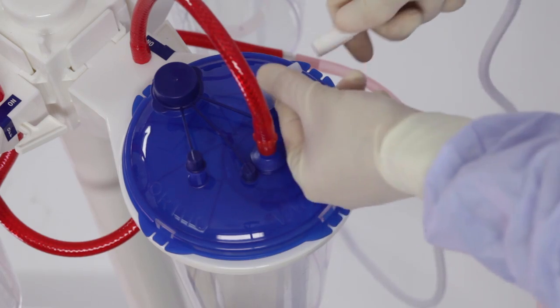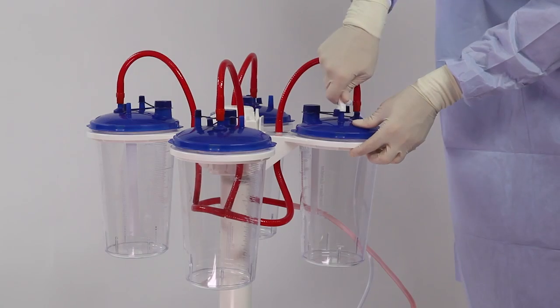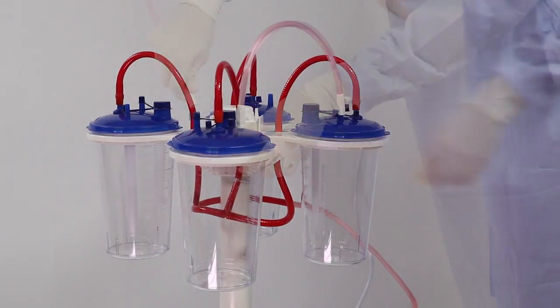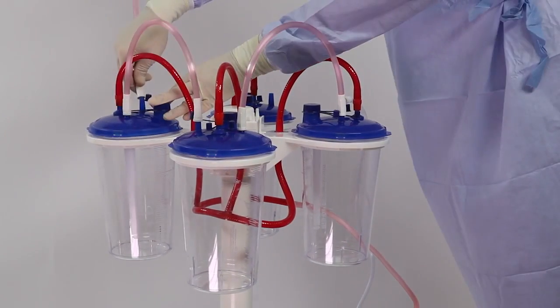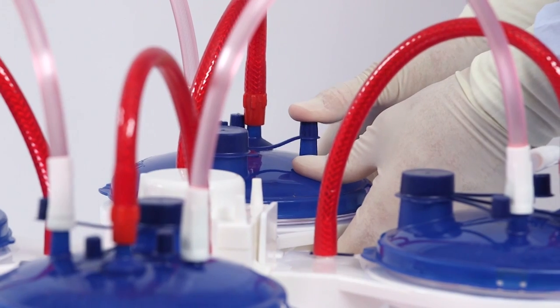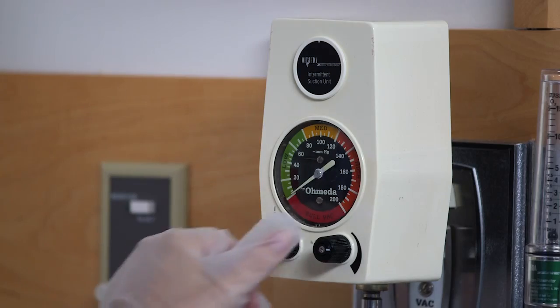On the first canister, attach the patient tubing to the patient port. Attach one end of the tandem tube to the ortho port on the first canister. Attach the other end of the tandem tube to the patient port on the second canister. Repeat this process until all canisters are connected. Verify that connections are secure, unused ports are capped, and the ortho port is securely capped on the final canister. Turn suction on using the on-off valve on each of the ring brackets or the regulator valve.